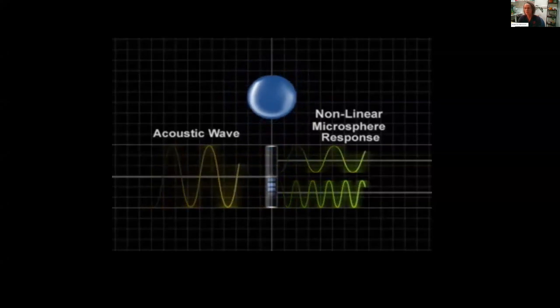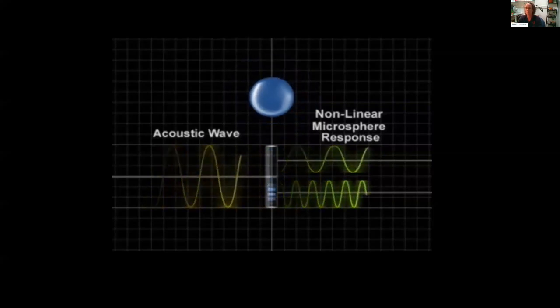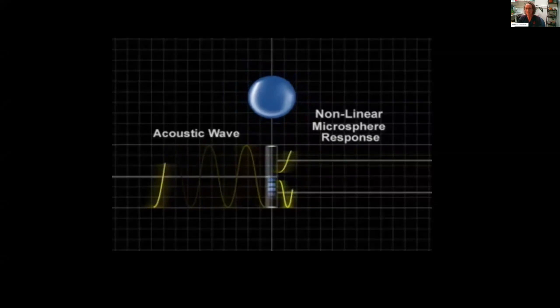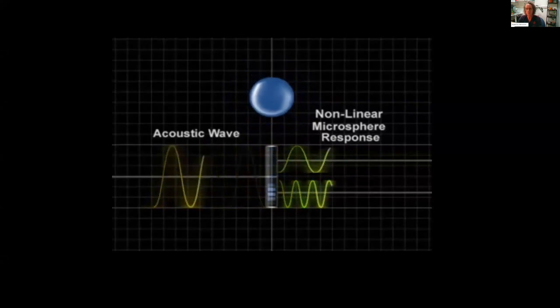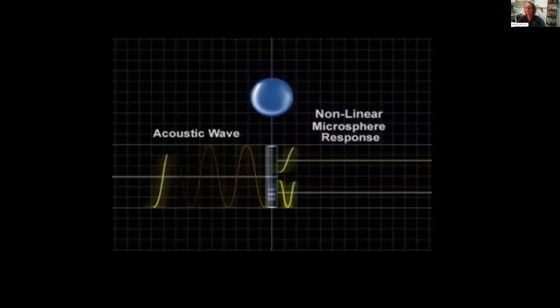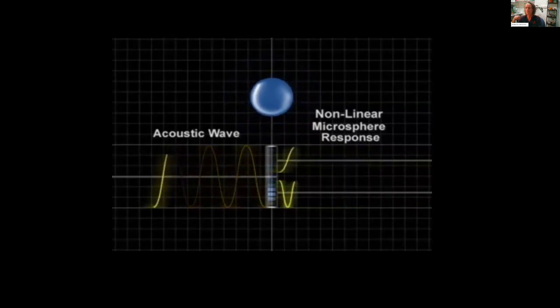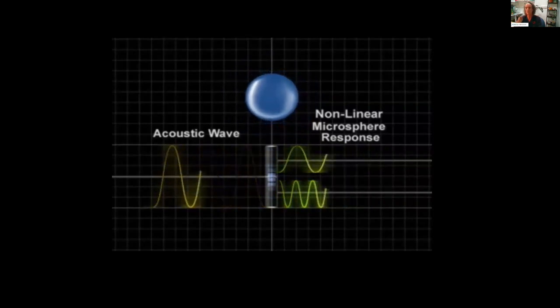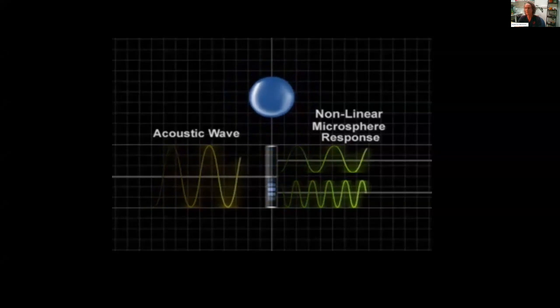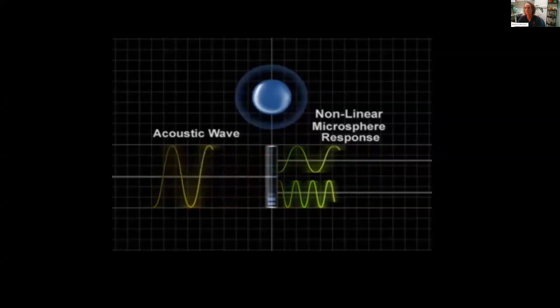Originally, methods of bubble detection consisted of harmonic imaging. It was a bit of a fluke. They experimented with bubble physics, and this is how they pretty much stumbled upon harmonic imaging. So what happened was they discovered this harmonic, the second harmonic, and then it was collected and filtered from the receiving signal. Now, this worked because microbubbles generate a much larger second harmonic signal than tissue.